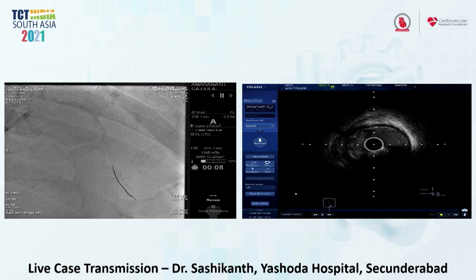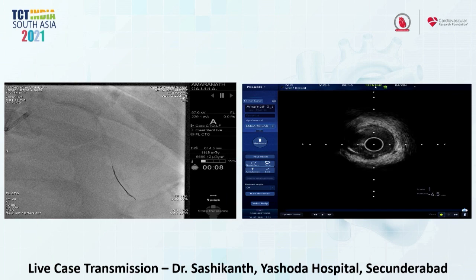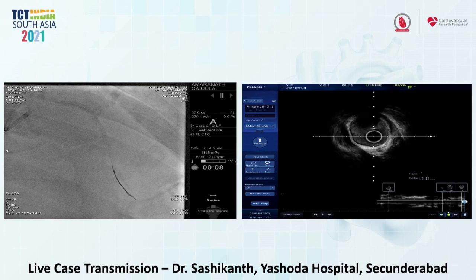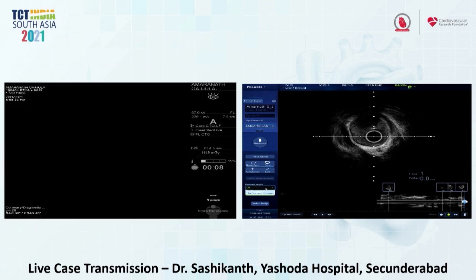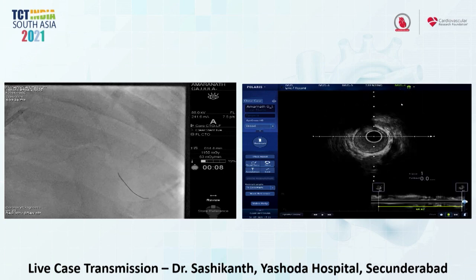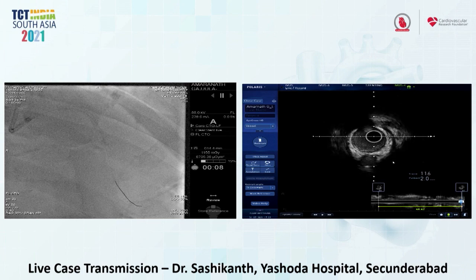Yeah, but if you go with the wired circ, you have a wonderful option to see where to stop with the stent in the LAD. Yeah, especially because you have an 8 French guide. And again, because this is a teaching course, I would say the safer way to do this is you put a wire in the circumflex, you put the IVUS catheter in the circumflex, and then you'll be able to get a view of the ostium of the LAD via the circumflex, and you would know exactly where you were, and you would not have to jail the IVUS catheter.